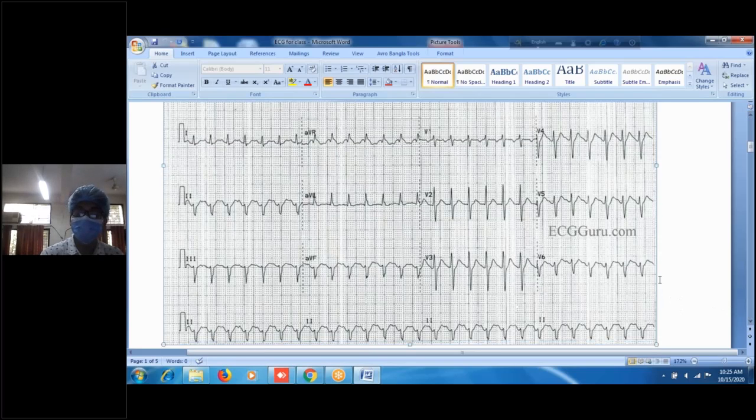This is a supraventricular tachycardia. And then what is the rate? Before telling the diagnosis, you calculate the heart rate beforehand. If the examiner asks what is the rate, you can tell, yes, this is the rate.